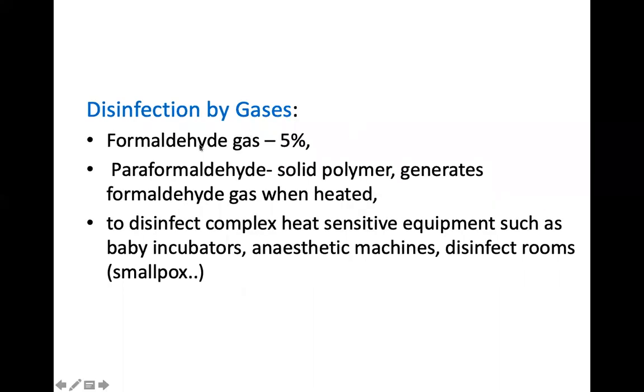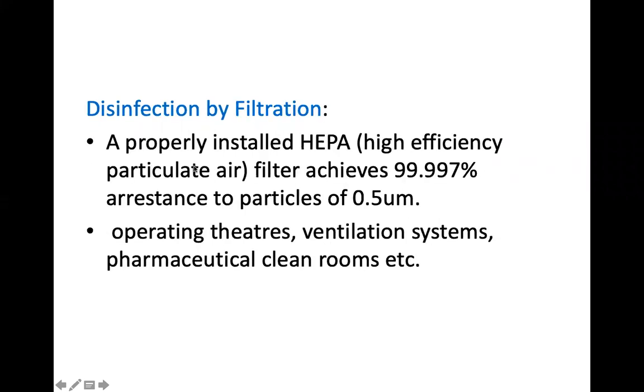Disinfection by gases, some of those gases I had mentioned before, at a lower concentration, you can use them to disinfect complex heat-sensitive equipment, like baby incubators, anesthetic machines, big rooms, large rooms, okay? You can disinfect them. Complex heat-sensitive equipment. You can also disinfect by filtration, okay?